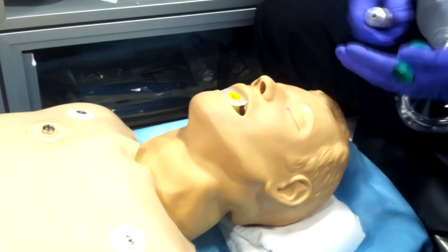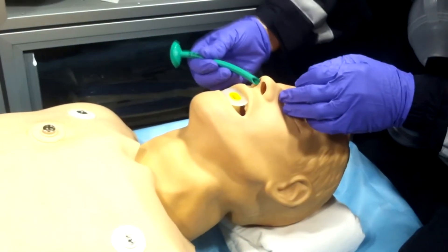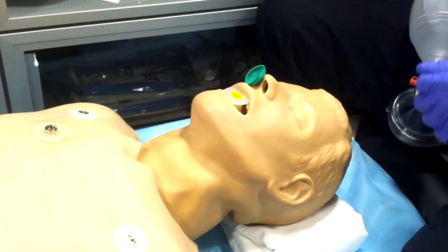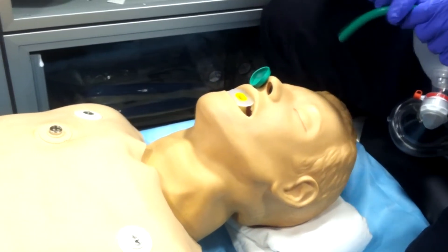The better way to bag somebody is with the use of an NPA, or nasal pharyngeal airway. Lube it up, bevel inwards, make sure it's properly seated without resistance — and that's the better way.